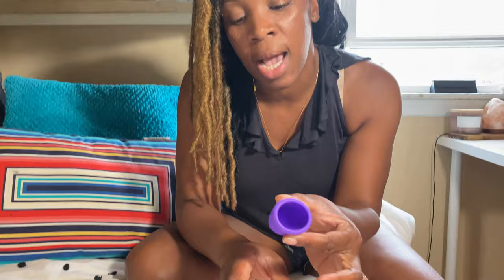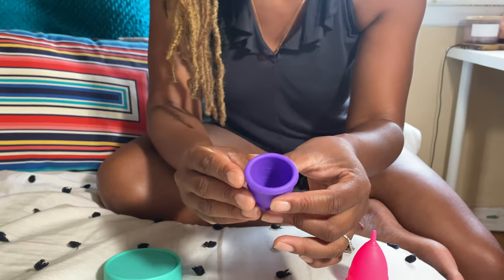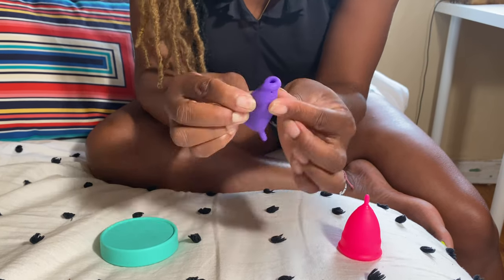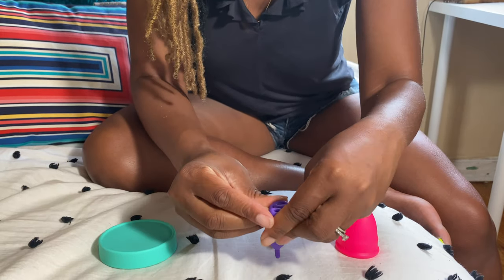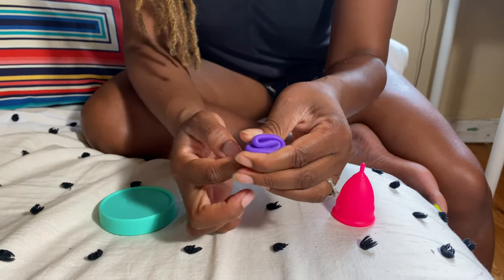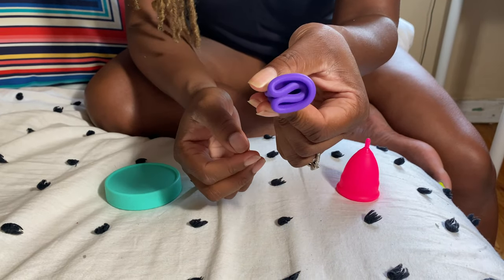The first thing is kind of getting used to the folds and how to fold — there are several folds. You can find them all over the internet, but you have to find the one that works for you. So some of the most popular folds: you push in and push down to get it to be the smallest ring for inserting it into the vagina. Then the next one, they call it the S-fold — it's not my favorite, but that's the S-fold. And then this is my favorite, which I use mostly every single time: the C-fold. It looks like this.